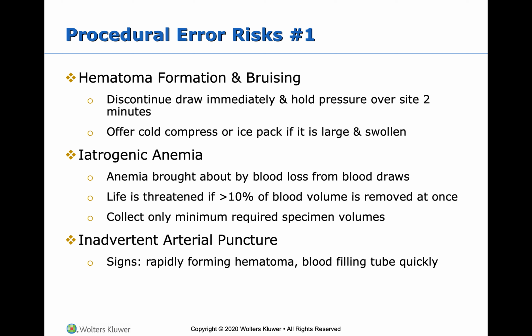If the arm is folded, to hold the gauze in place after venipuncture. So like I said, you're never going to let the patient bend their arm up to hold the gauze. You are either going to hold pressure on it or you're going to have them hold pressure on it. But they're not going to bend their arm to hold pressure on it. That's not an option either.